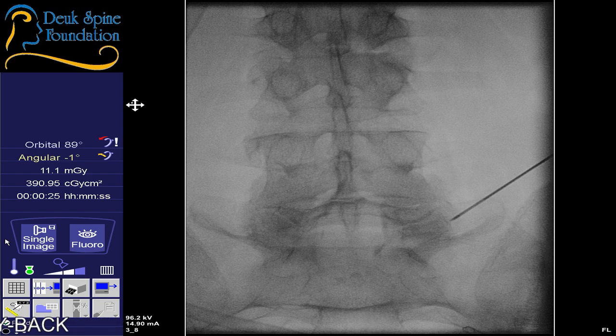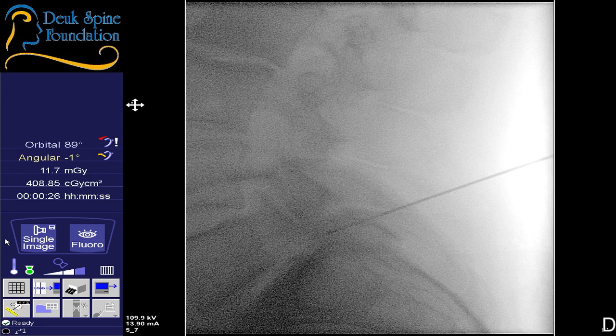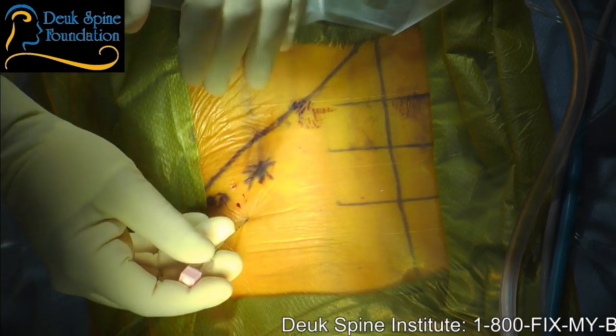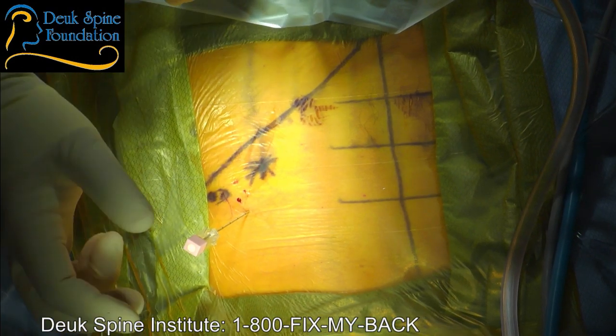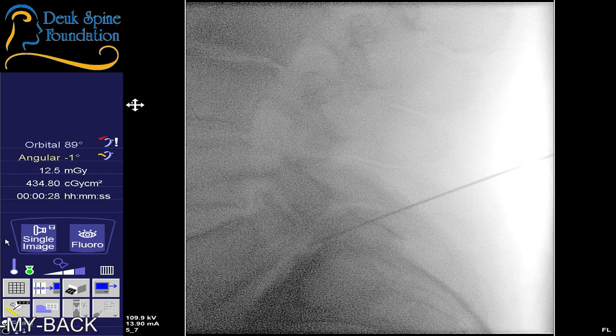I'm just amazed at your anatomy, because your L5-S1 disc is so steep that we really start quite high up on your back to get to it. It's not a problem. We're going to get the job done, but it's just very different, you know? Shot, it's okay. You're doing fine. Now, you're going to let me know if you feel any discomfort, right? I can feel all the scar tissue. Shot. I can feel all the scar tissue from your fracture. There's really quite a bit of it.